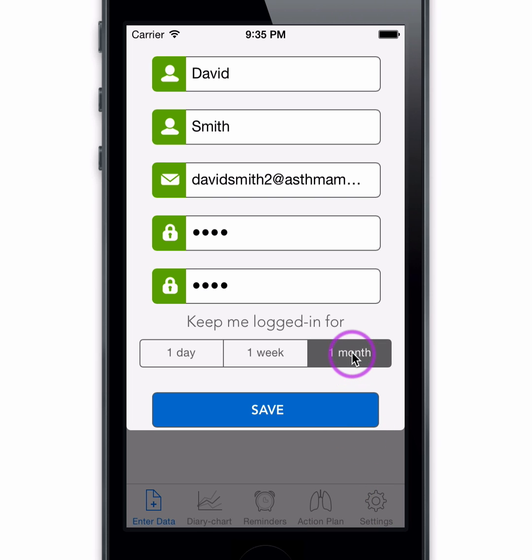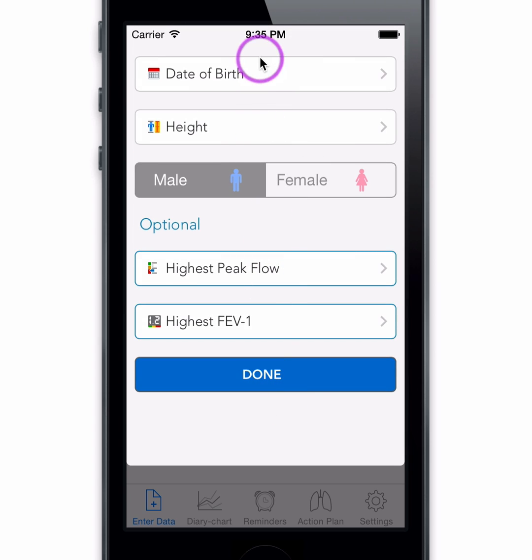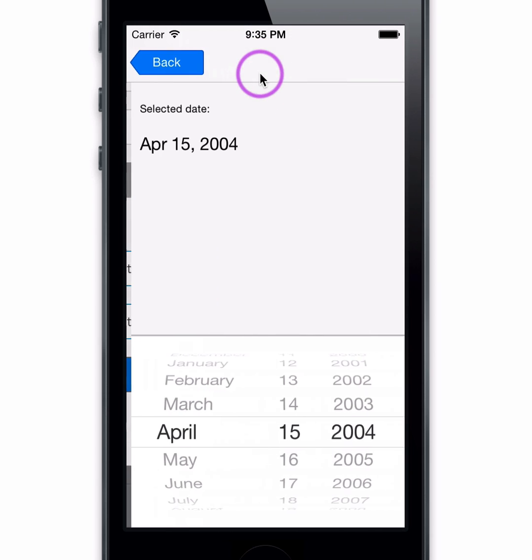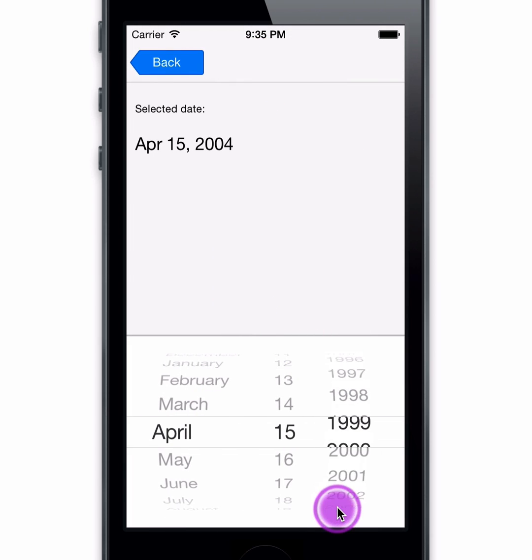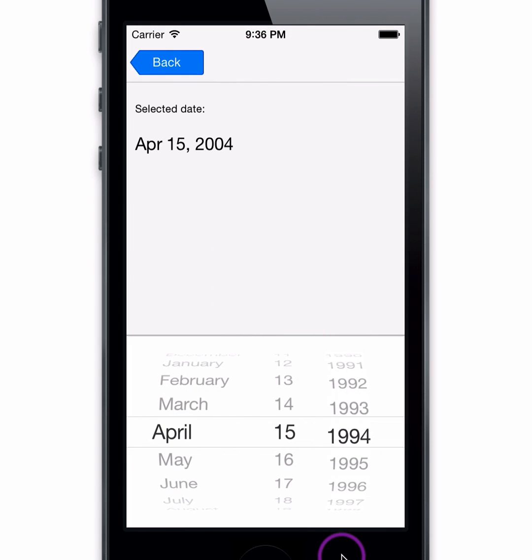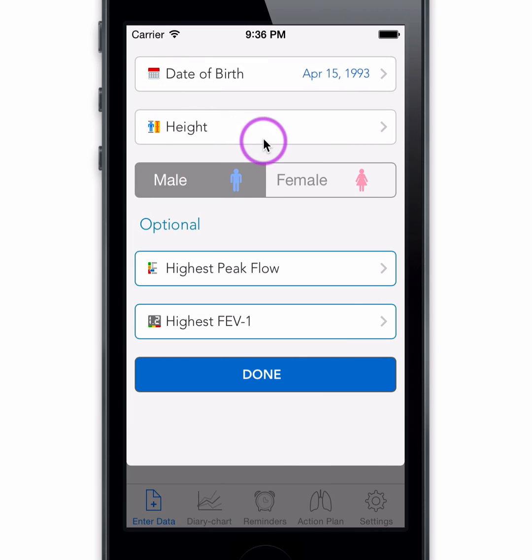Select the duration to be logged in. To personalize the app, select your date of birth and height.